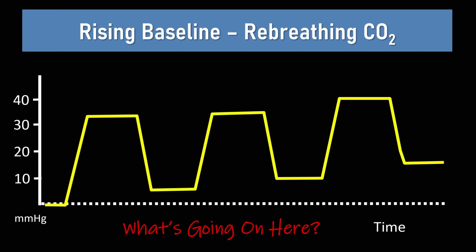The commonest cause for this in the operating room is that the soda lime that is used to basically remove carbon dioxide from the system has been exhausted, the flow is low, and there isn't CO2 being cleared, so it's coming back on the inspiratory side of the circuit, and the patient is rebreathing carbon dioxide. You sometimes see this with pediatric circuits where the child is breathing so much and generating such a high minute ventilation that the bag that is used as a reservoir essentially doesn't have enough time to fill and clear CO2 out of it, and the patient rebreathes CO2. So what needs to be done here is the flow needs to be turned up and the soda lime needs to be replaced.